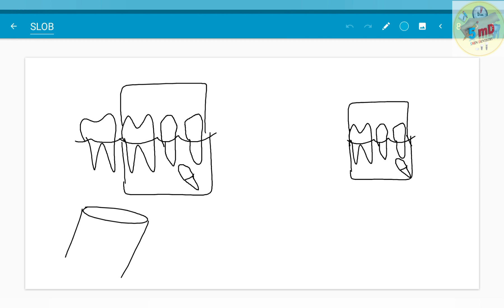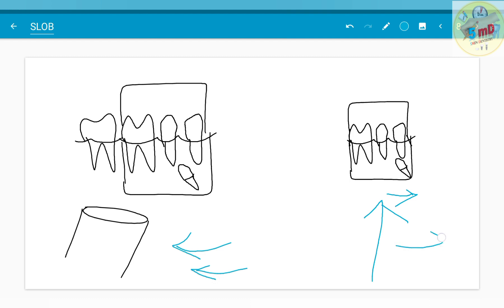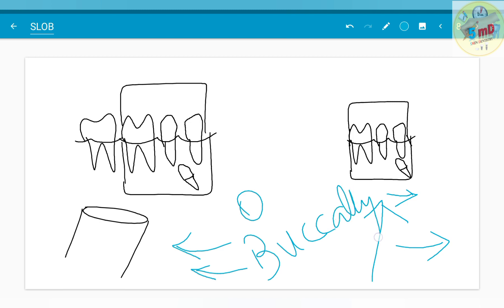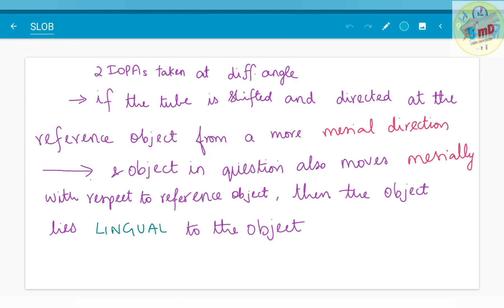Now see this example. The tube has been shifted distally, but the object has shifted mesially when compared to the first IOPA where the projection was done at a straight angle. This kind of result denotes that the object is placed buccally. The tube shift direction and the object shift direction are opposite, therefore the object is placed buccally. This rule helps you determine whether the object is placed lingually or buccally — same-side shift denotes lingual position, and opposite-side shift denotes buccal placement.